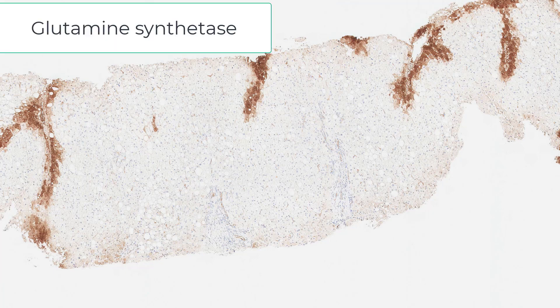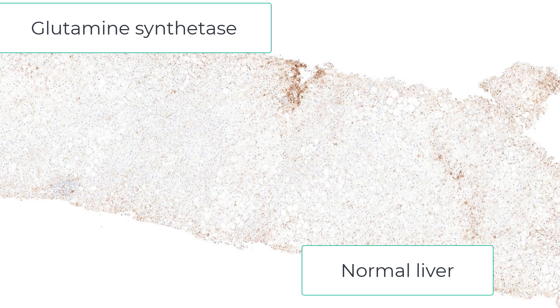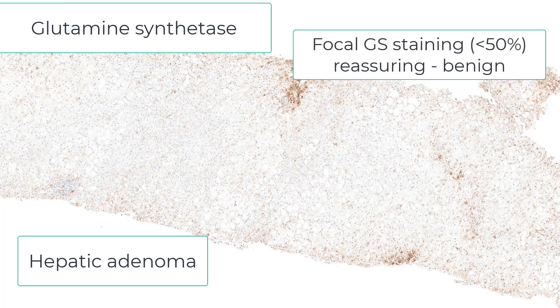Let's take a slightly closer look at the GS stain. This is normal liver staining around the central veins. This is lesional tissue — it's largely negative. But don't be afraid if you see a little bit of GS staining; I've noticed that this does happen with fatty adenomas. Remember, as long as it's not diffusely positive — that is, greater than 50% staining — there's nothing to worry about.